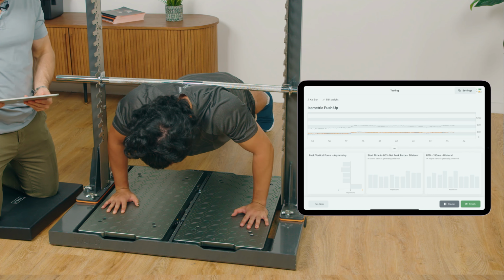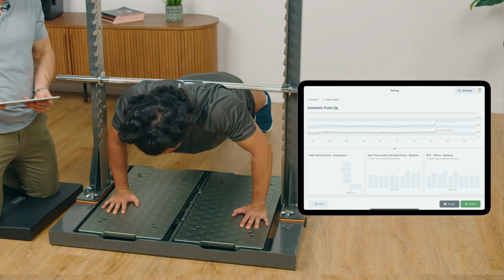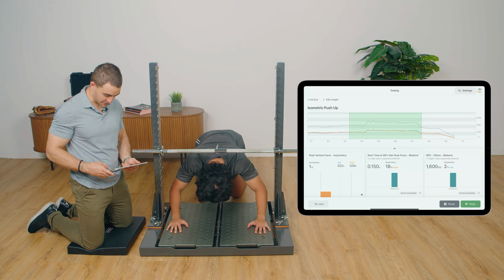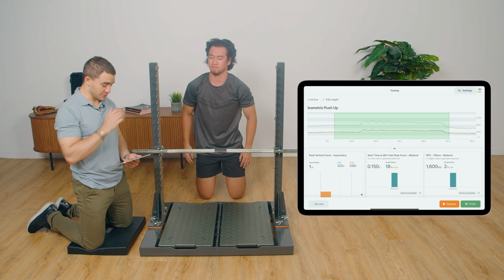3, 2, 1, go. Push, push, push, and relax. Nice. Perfect, and it picks up our rep there. Hard to do multiple, so I'll just do one for now.